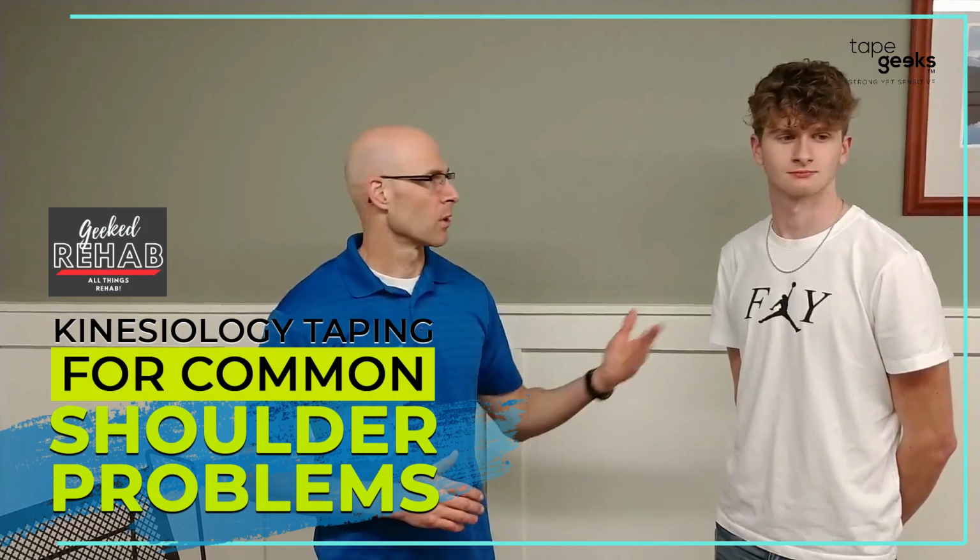We're here today with my buddy Will, and we're going to go over some taping techniques for one of the most common shoulder problems that people have, which is shoulder impingement or shoulder entrapment. That's basically causing pain right over in this section of the shoulder with any overhead reaching, reaching behind the back if you've got to get something out of the back seat of the car, or tucking in your shirt or anything you're doing back there. Those are the three most common movements that result in pain.